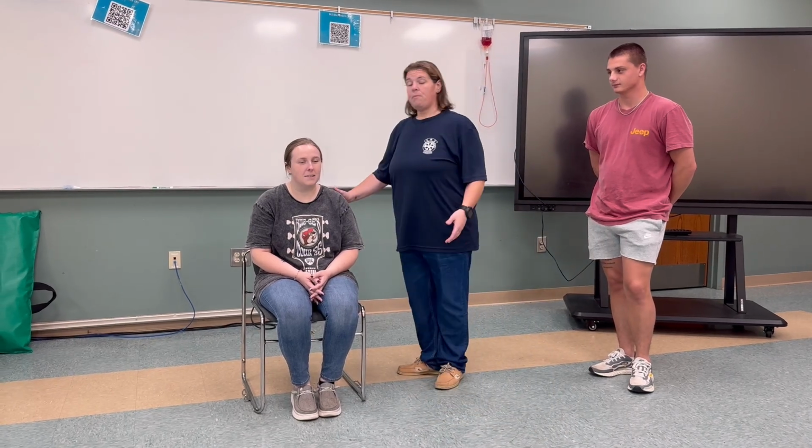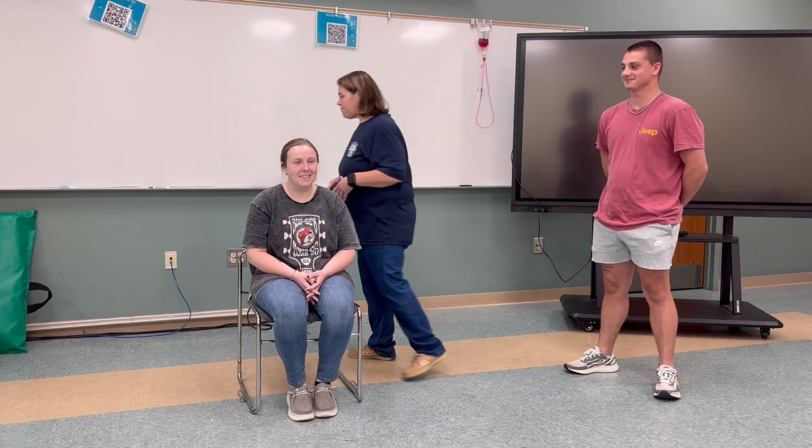But it can be used for patients who are in a motor vehicle accident to extricate them out of the car, or if you have grandma or grandpa who fall in the Bermuda Triangle between the toilet and the tub and they're sitting against the wall. So, this is Zoe. She is going to be my patient, and this is Aiden. He's going to be my partner in this.